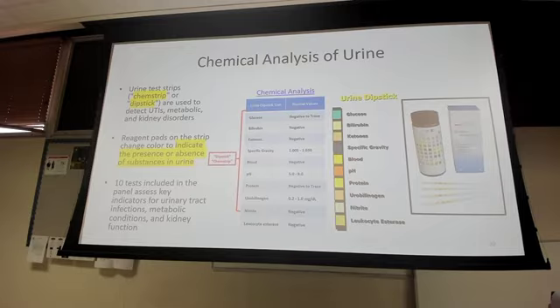All right, but this we will report to you. Chemical analysis of urine, all right? You will see it when we present our panels. It will look like this. You've seen my test, right? So I will have the actual test itself, we will have the value, and then the normal values will be off to the right, okay? Just know that chem strip and dipstick are interchangeable. Any questions so far? I've been going through these slides.